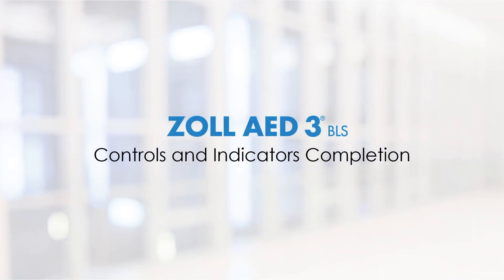You have completed the module that guided you through the controls and indicators on the AED-3BLS. Continue to the pad options module.